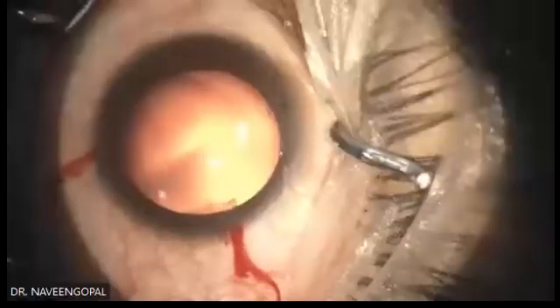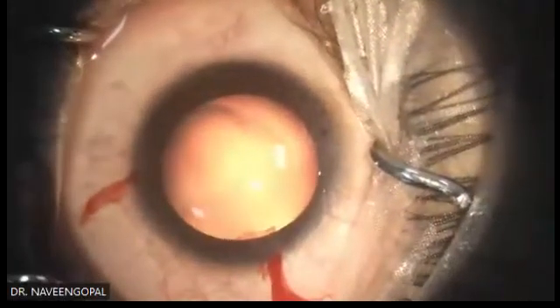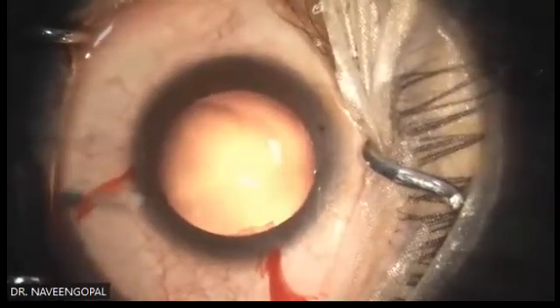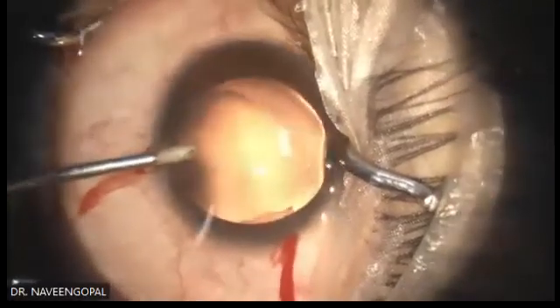To fixate the globe, you can do 2 things. You can either hold the globe in Hoskins forceps, or you can do this technique. Give me the lens. I hold, I stabilize.